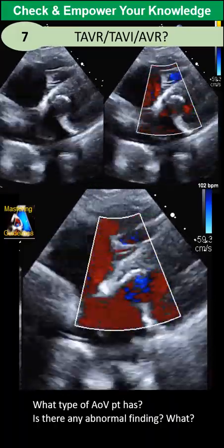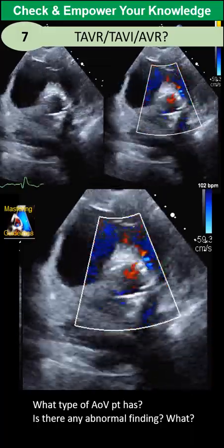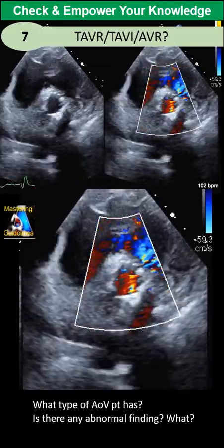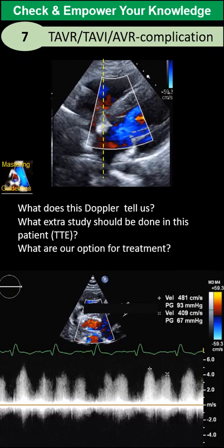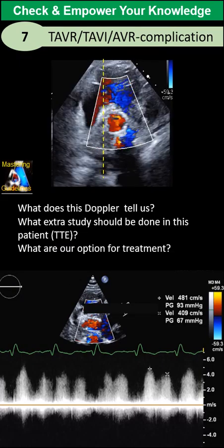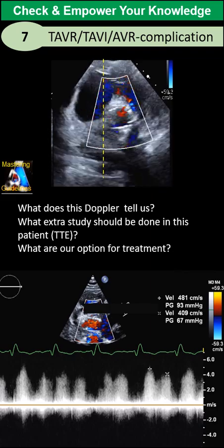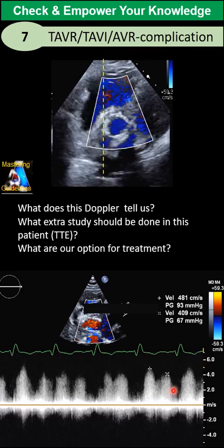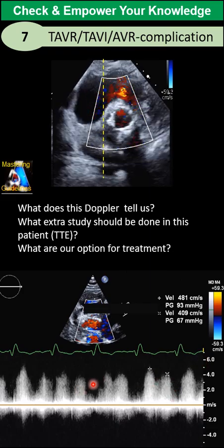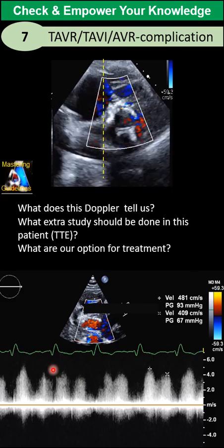Third question: what should you do in this case? What is the important study you need to perform at this level? Based on the findings, we decided to perform Doppler at that level, as you can see here. Now, looking at this Doppler — what does it represent, and what is the diagnosis in this case?